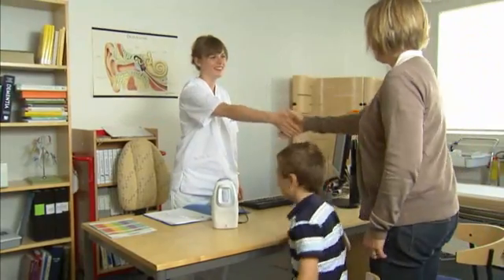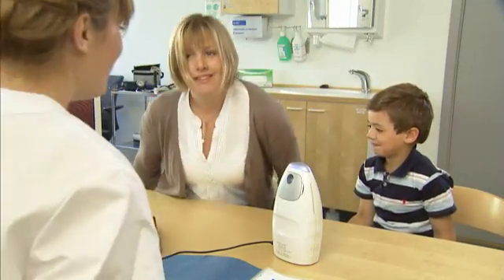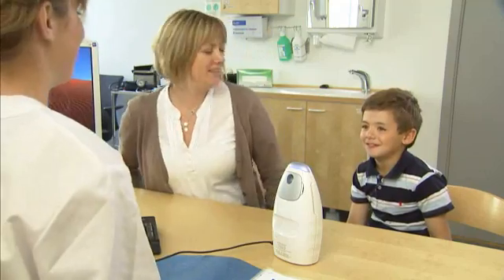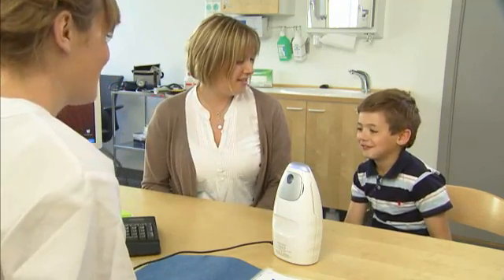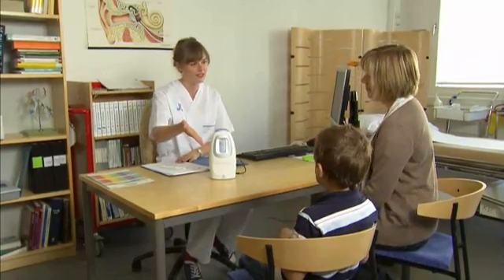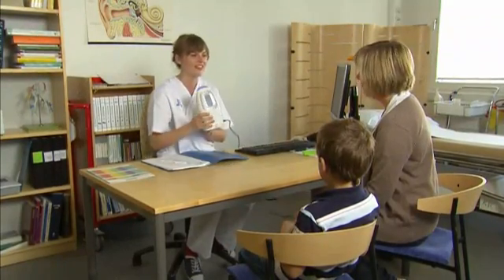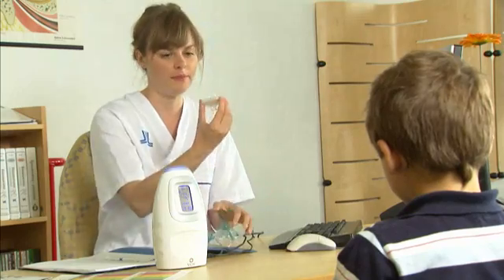In just a few years, NIOX MINO has become the most widely used device for monitoring airway inflammation. Millions of tests have been performed in clinical and research settings. All major pharmaceutical companies use NIOX MINO in their clinical trials.